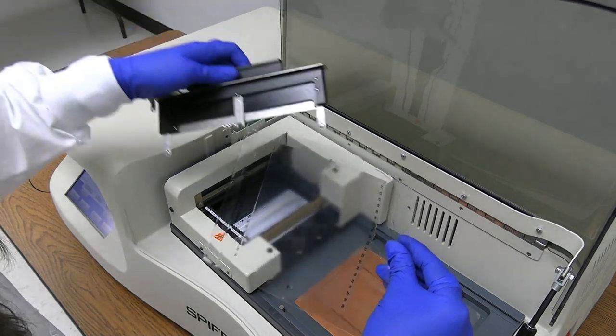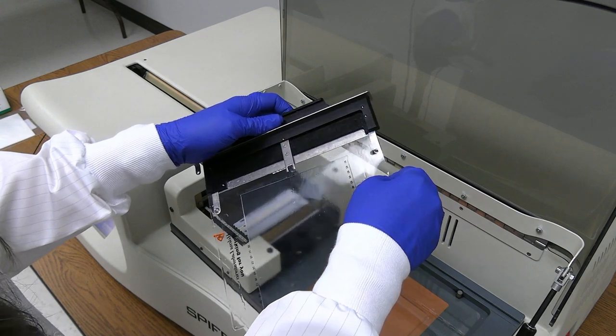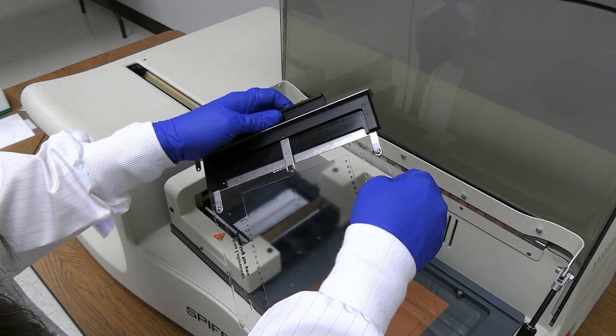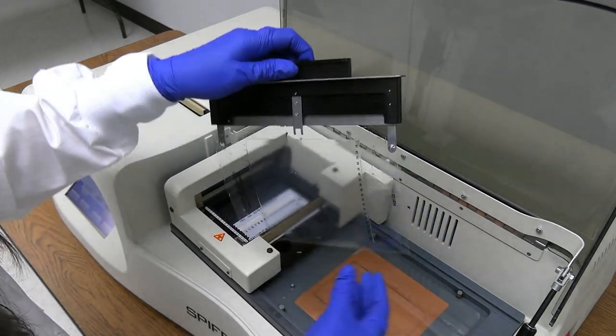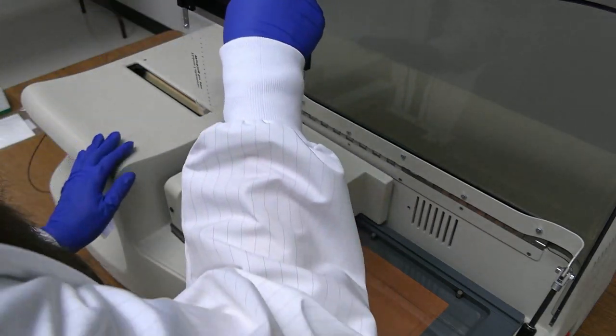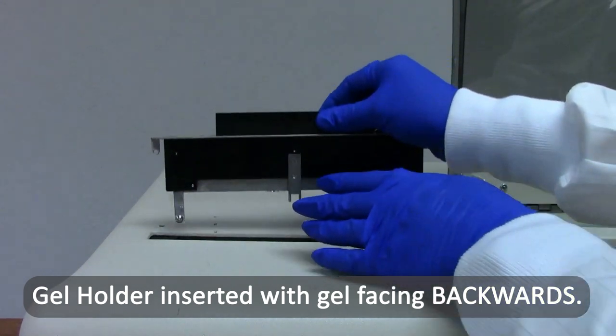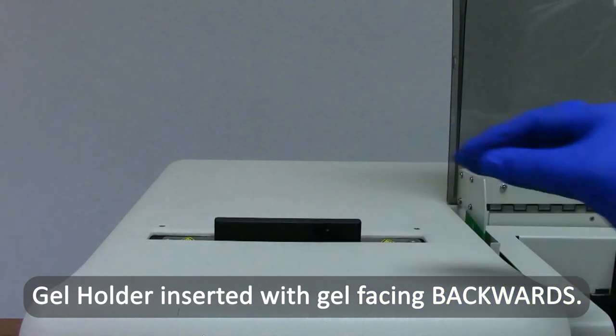And remove the gel holder from the stainer unit. Attach the gel to the holder by placing the round hole in the gel backing over the left pin on the holder and the round hole over the right pin on the holder. Place the gel holder with the attached gel facing backwards into the staining chamber.